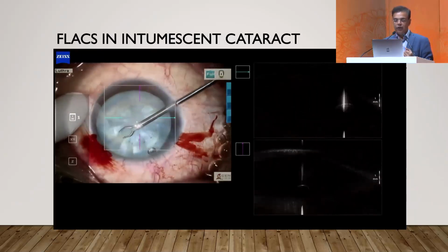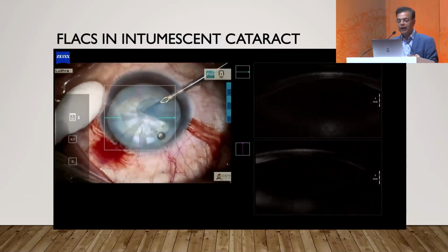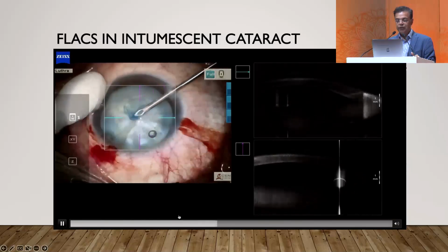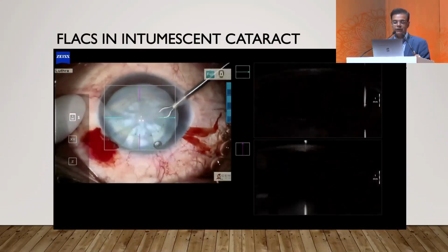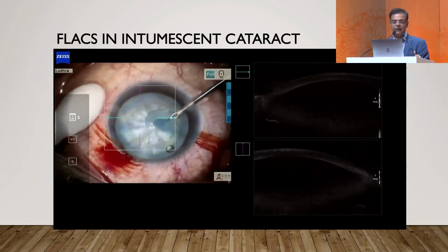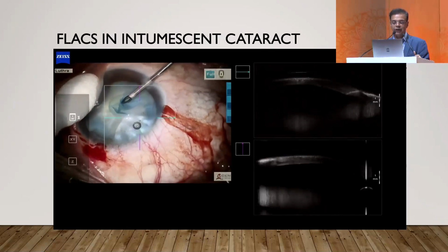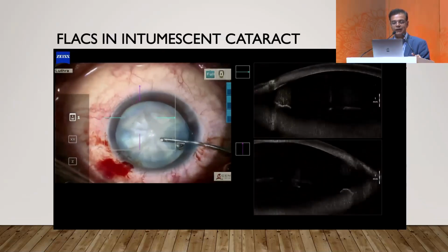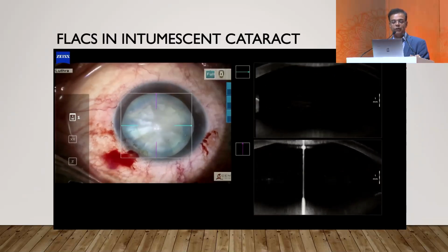In fact, with all semi-opaque or opaque cataracts, it's a good idea to stain them. If you see the way I'm trying to complete the rhexis, even though it is actually complete, I'll go back over there and just see the motion, because it has been shown in the past when we were into femtos that you can just pick up the rhexis. But in many of these cases, if there are small islands of adhesion still left, it's a good idea to do it just like you would normally do a rhexis, with a forceps or with a needle, whichever way you like, because that way you will not have a broken rhexis.